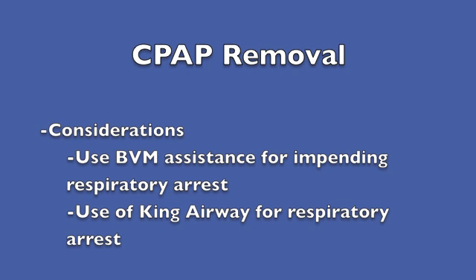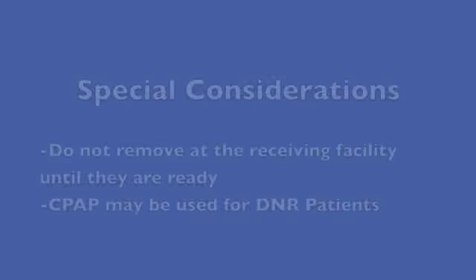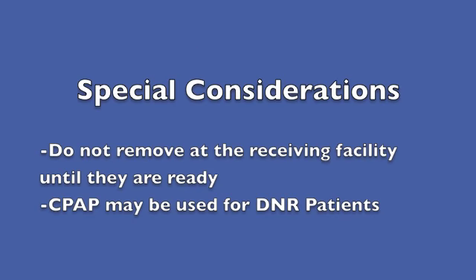CPAP removal considerations. Use the bag valve mask assistance for impending respiratory arrest. Use the King airway for respiratory arrest. Special considerations for the CPAP include: do not remove at the receiving facility until the staff are prepared and ready. The CPAP may be used for DNR patients.